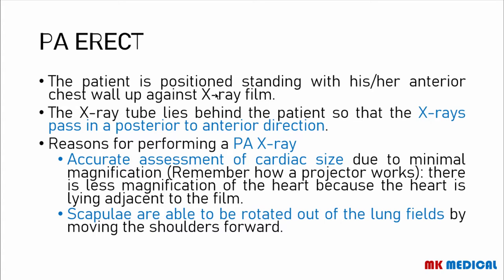If your answer was that the image will be smaller, you're indeed correct. If it was larger, then you're not making sense. So if you take your projector and put it towards the wall or towards the board, the image becomes smaller, almost like the actual size. Now if you take the projector far away from the board, the size of the image begins to increase. That's why at the cinema, the projector is a distance from the film so that they can make the screen as big as possible. That's just basic common sense or basic logic.